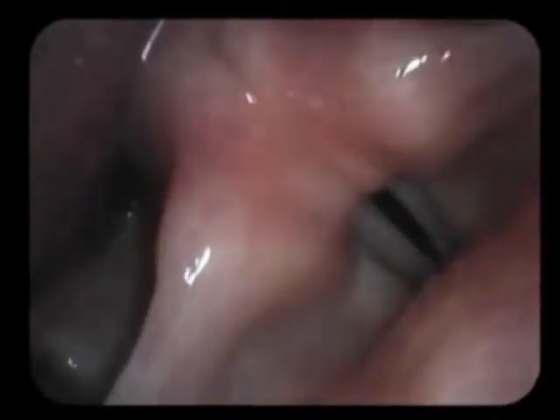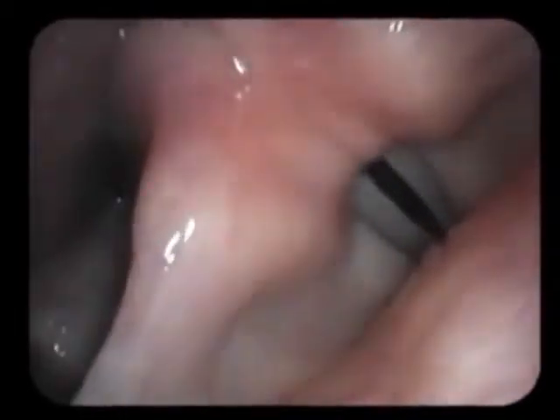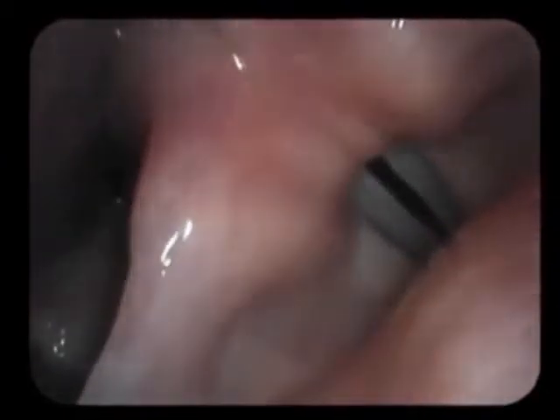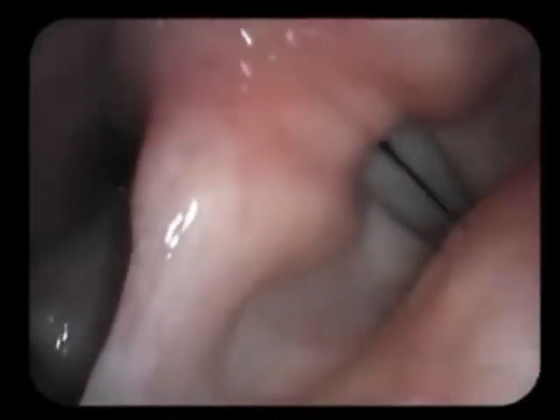We will look for symmetry and suppleness of the vibratory wave. We will look to see how well the person completely closes them, how much time they spend closed, and some other details of the vocal cords.